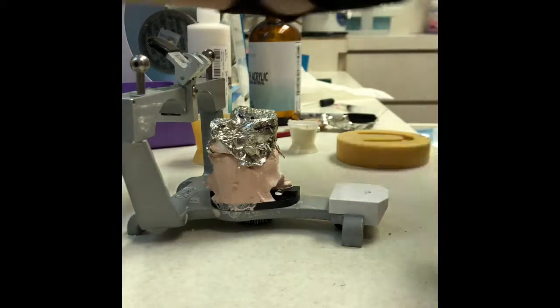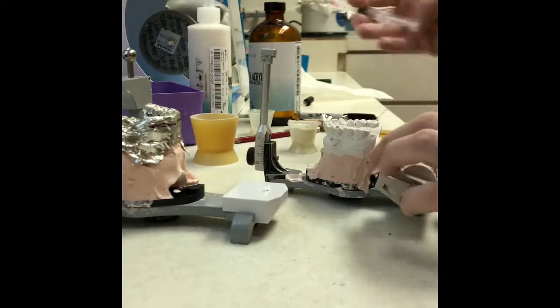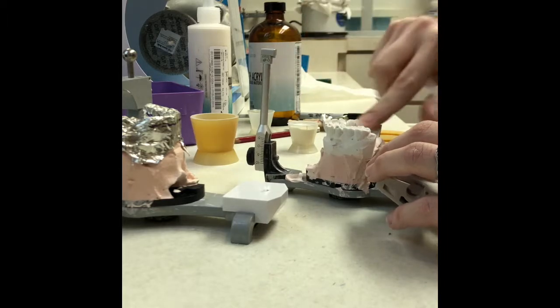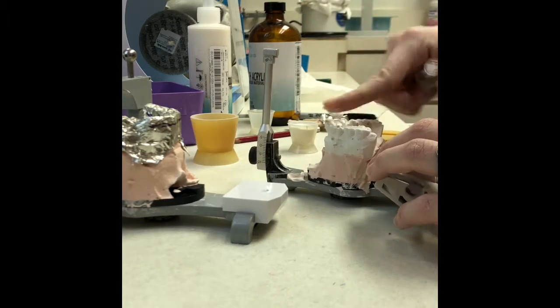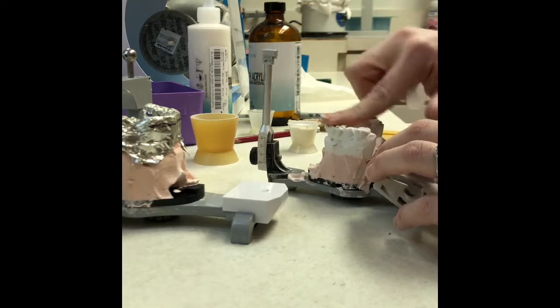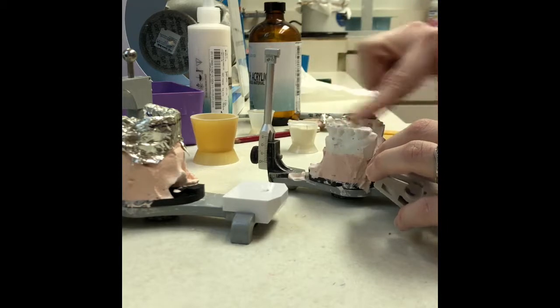The upper cast gets Vaseline, copious amounts of Vaseline, especially on the lingual surfaces of the upper cast, to make sure that it doesn't actually get stuck onto the acrylic material.